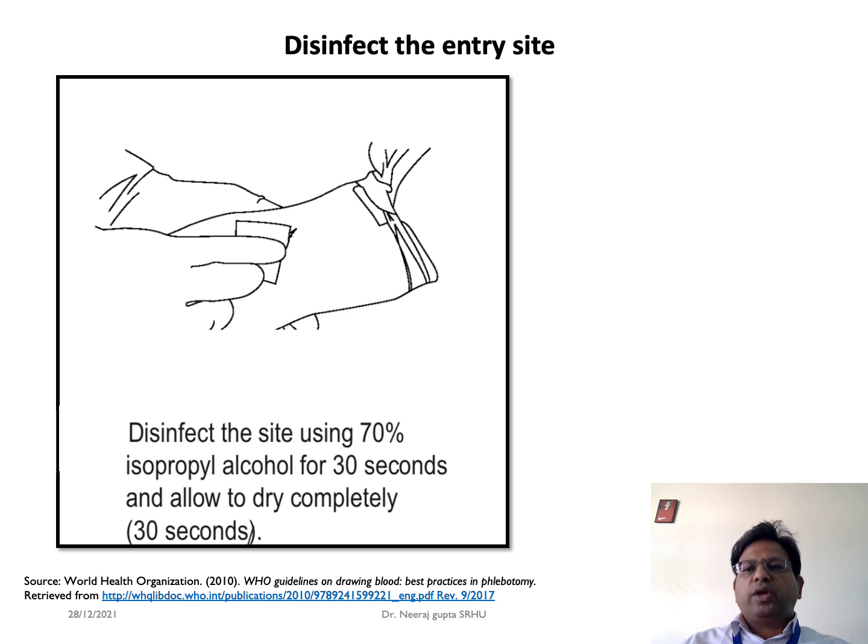Failure to allow enough contact time for alcohol will increase the risk of contamination. Do not touch the clean site. In particular, do not place a finger over the vein to guide the shaft of the exposed needle. If the site is touched, repeat the disinfection process.